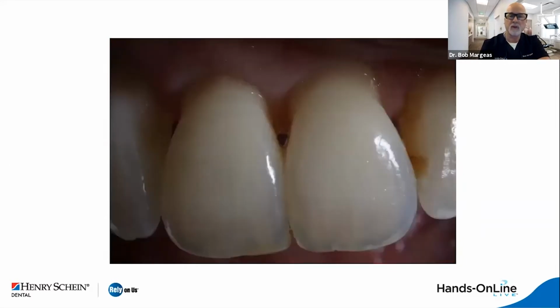If we look at this one, notice at the edge of the incisal and at the 3 lobes of the dentin, there's a higher degree or saturation of color. There's more chroma. And you see the interproximal and you see the incisal almost looks like a violet or a blue type incisal. I'm going to try to show you how we can create that, along with those little wisps of enamel that look like enamel fractures. We'll put those in the tooth also.